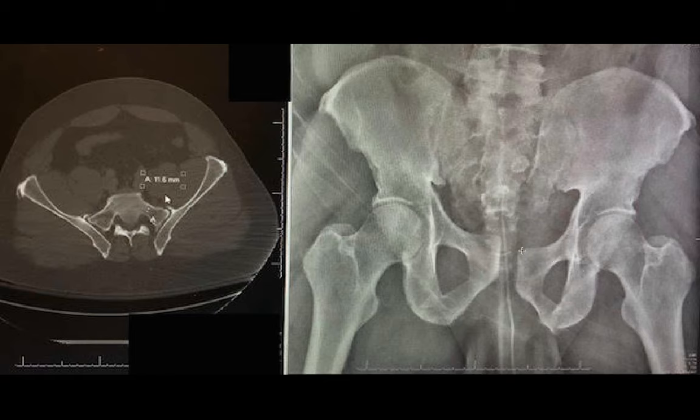Now, the inferior displacement here could be partially from the rami fractures, but most likely it is due to the fact that as the SI joint gaps in the front, it also opens up like a book, but not just outward, it opens inferior. So this is pretty common with SI joint opening, that it sags like that.